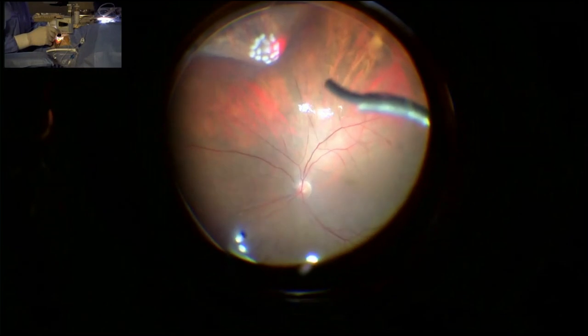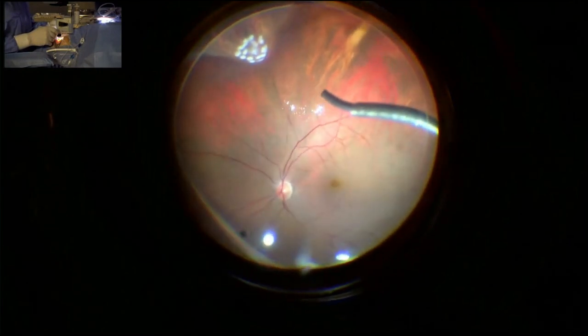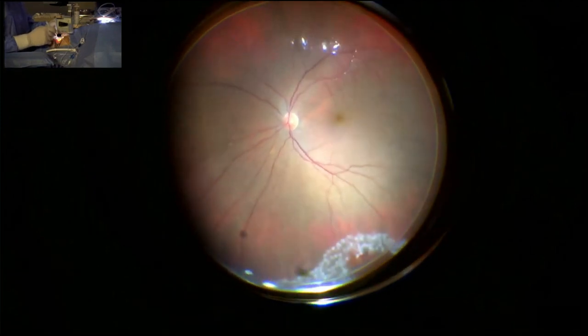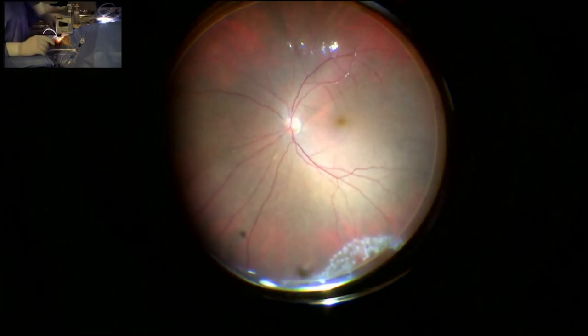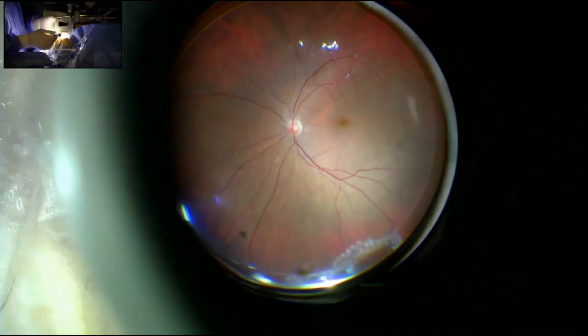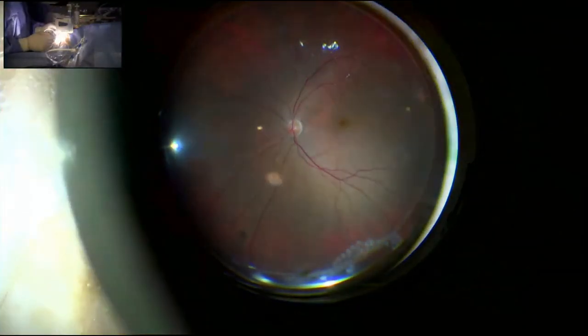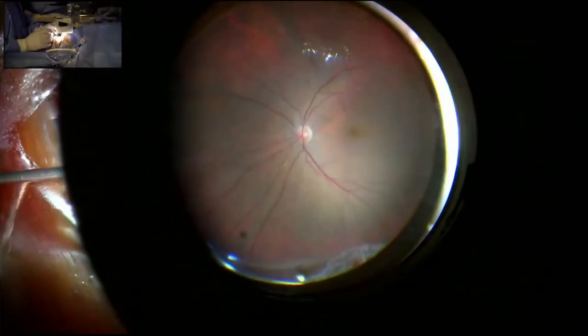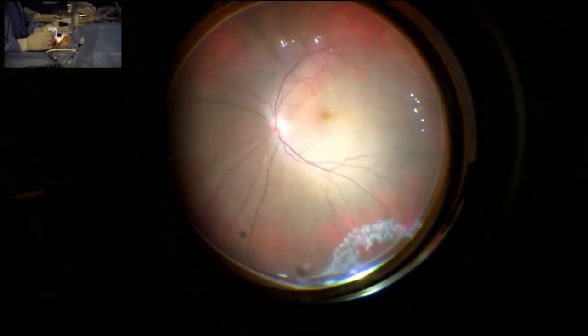Maybe we can narrow the view a little bit, and the retina is completely attached. Now we will do fluid PFO perfluorocarbon air exchange, then we will give C3F8 gas tamponade.